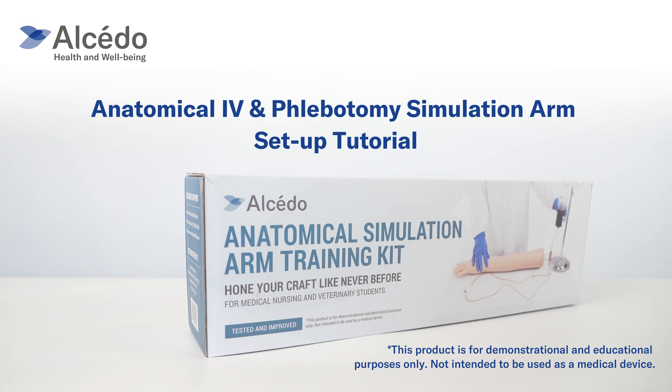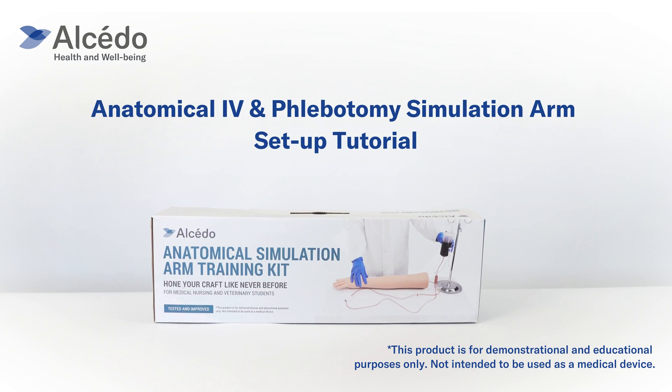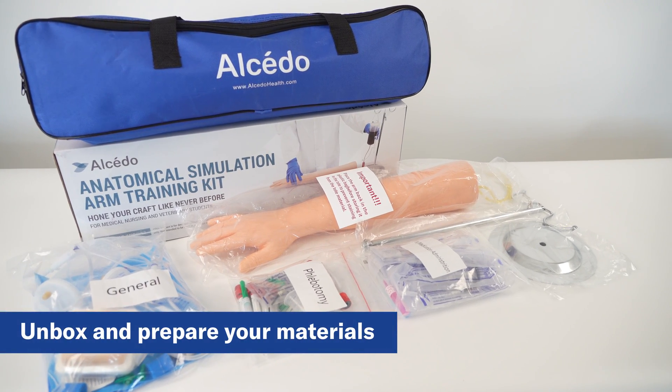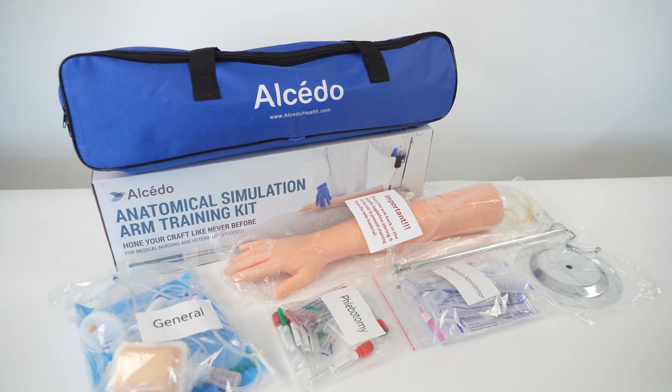Welcome to the setup instruction tutorial for the Alcedo Anatomical IV and Phlebotomy Simulation Arm. First, unbox the kit and make sure you find all the following packages and items.